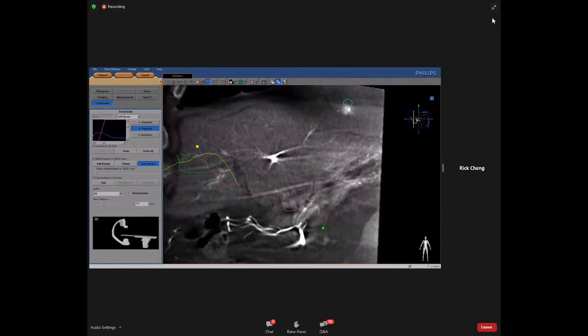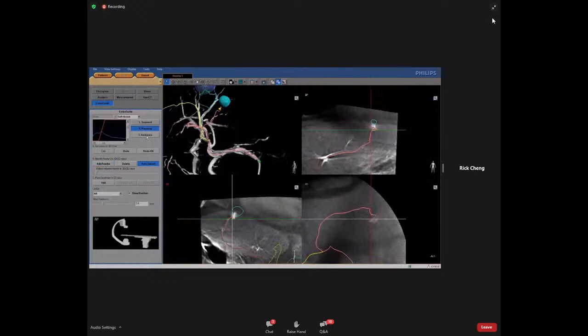Sometimes a feeder is not detected automatically. This can be due to a lack of contrast, patient movement, or a mismatch in the registration. It is still possible to add feeders manually. Select the Add Feeder button and click on the tumor to add a feeder manually. EmboGuide is still able to add the correct vessel path.